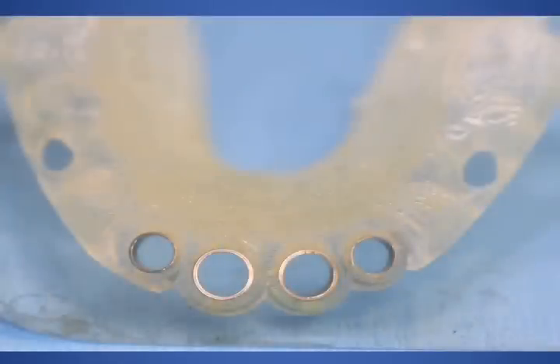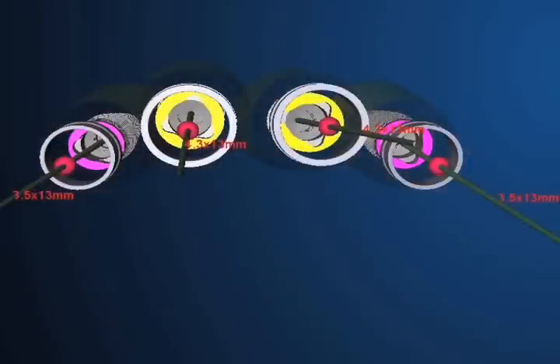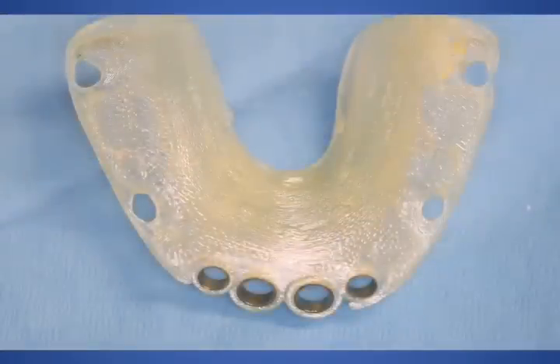To do this, we would create a surgical stent in the dimensions regulated by the parent company, but the challenge would be the metal sleeves or rings that would allow us to place the implants in the correct position. How could we stabilize those rings appropriately to use it as a surgical guide? The acrylic that was used would be an overlay similar to a bite splint. It would have to be stable, not move, and allow us to position the implants correctly.